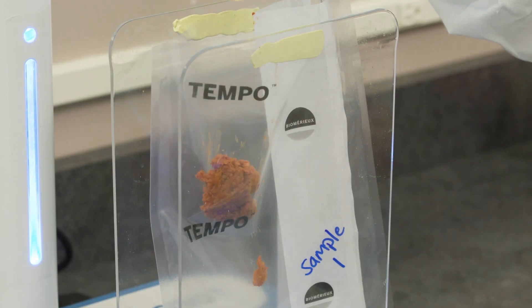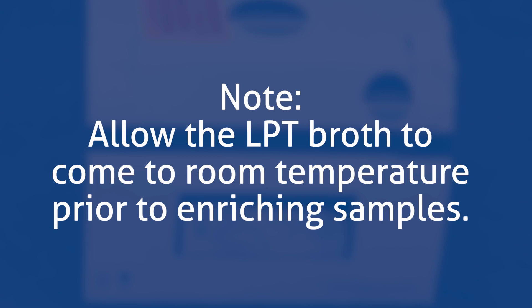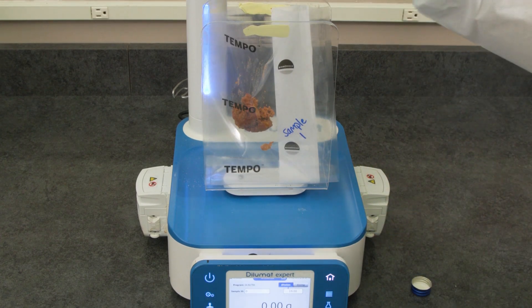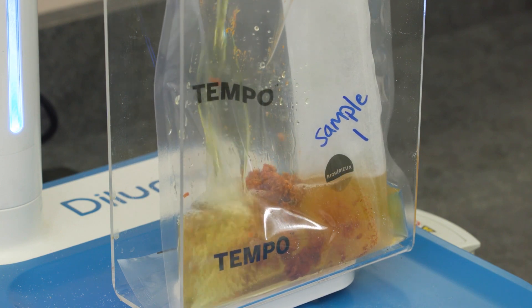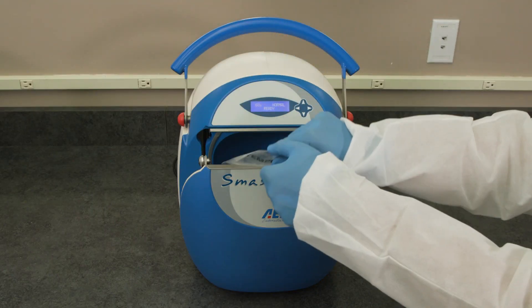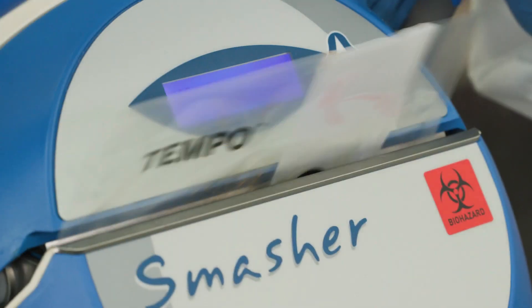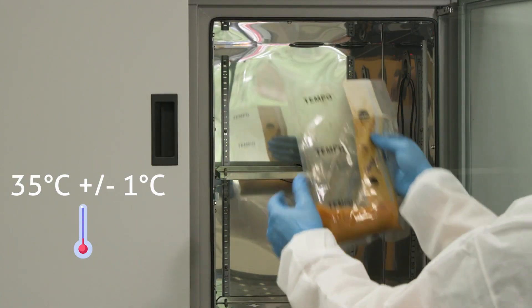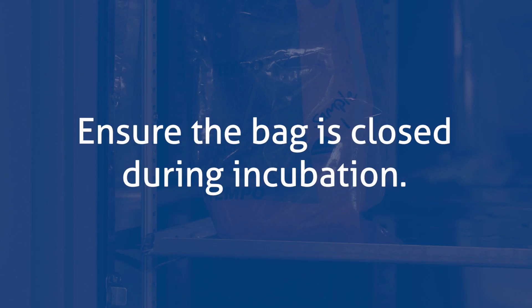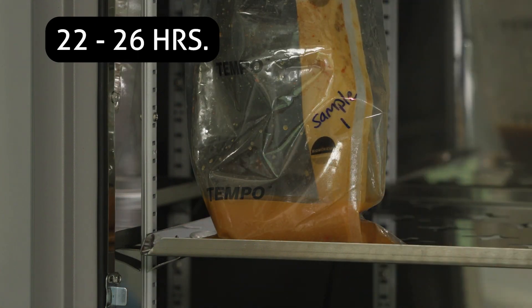Next, add sample to one side of the bag until you reach 25 grams. Allow the LPT broth to come to room temperature prior to enriching samples. Add 225 milliliters of room temperature LPT broth to the sample and close the bag. Place the sample in the paddle blender and homogenize for 60 seconds. Remove the sample from the paddle blender and place into an incubator set to 35 degrees Celsius plus or minus 1 degree Celsius. Ensure the bag is closed during incubation. Incubate for 22 to 26 hours in an upright position.